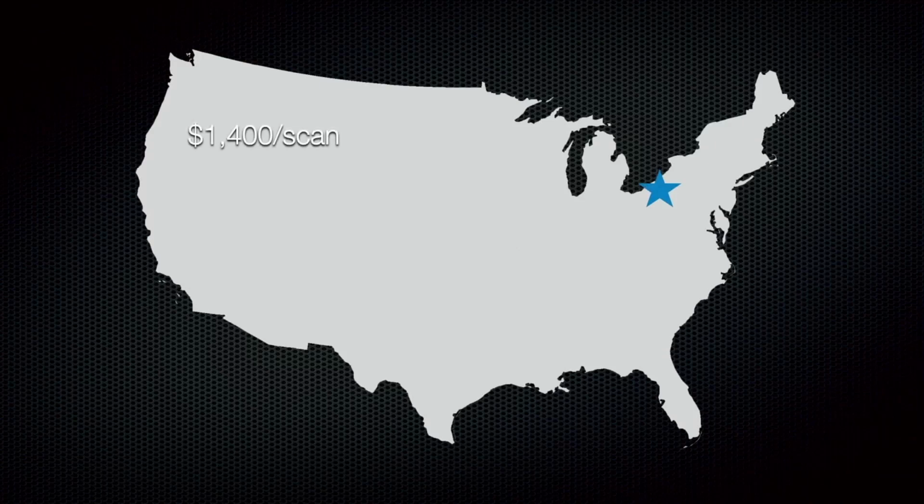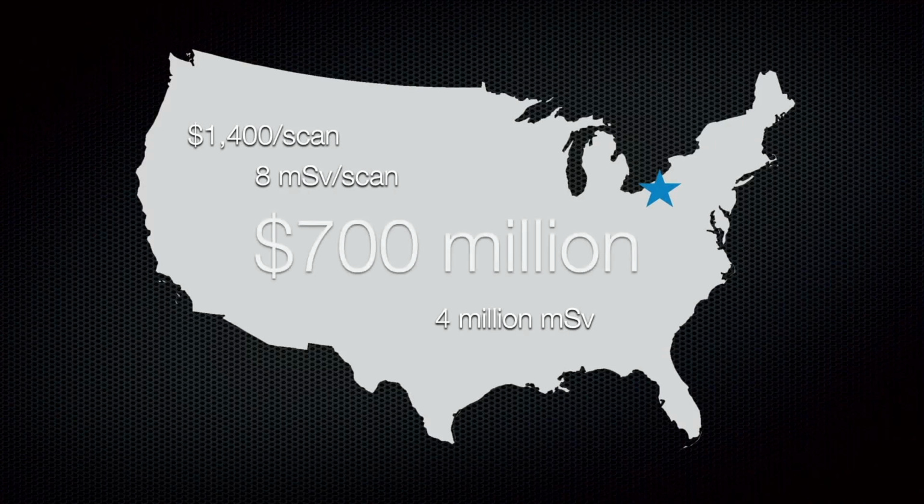And I wrote this lecture, at least this slide, a handful of years ago. And so with all the inflationary forces at play, that number is probably a little bit different at this point. But also 8 millisieverts of radiation per scan. If we're doing that many scans, we basically have 4 million millisieverts of radiation that we're inflicting upon Americans every year at a cost of about $700 million annually for the evaluation of kidney stones in the United States. And so it begs the question, is this an appropriate utilization of radiation?